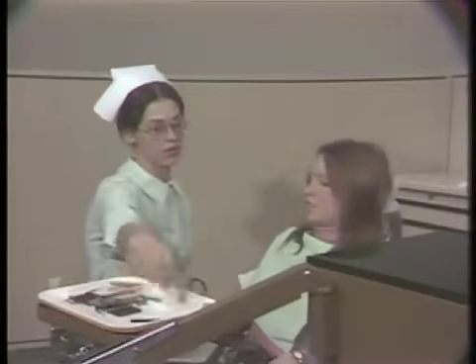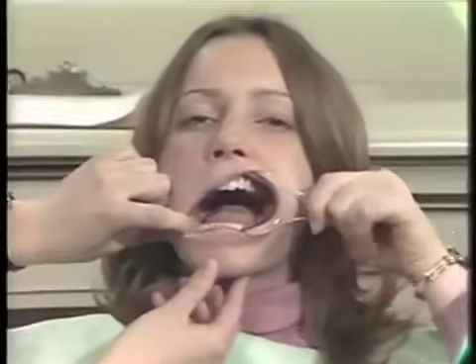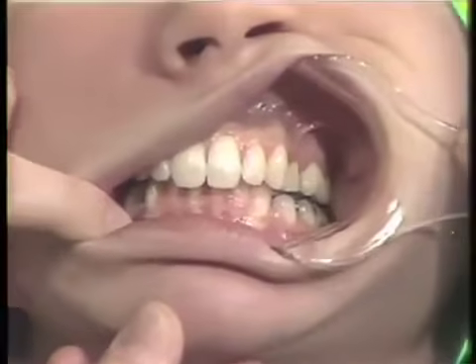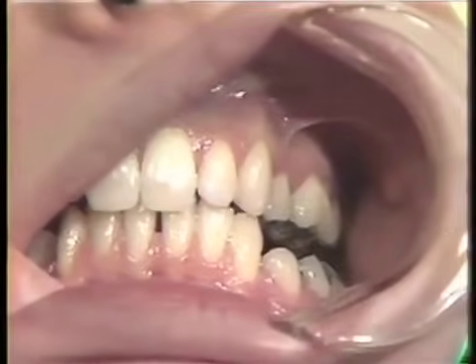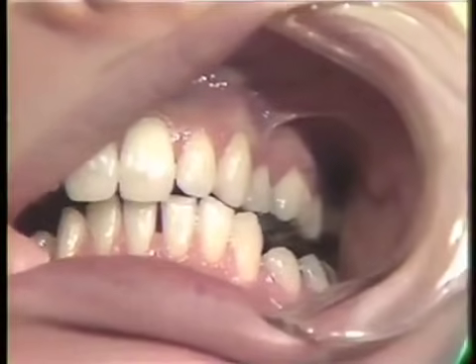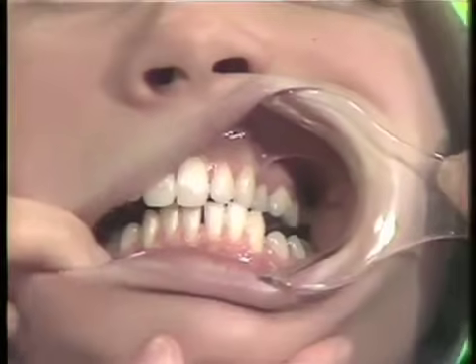I will now ask the patient to go into lateral excursions. Bite your back teeth together please. And come out on the left here. Just a little bit more. Go back a little bit. We're looking for the balancing and the working contacts here.